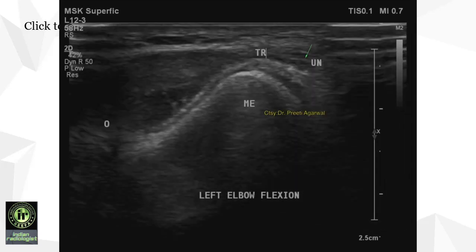On flexion, abnormal subluxation of the ulnar nerve is seen way beyond the medial epicondyle of the humerus. The normal position of the triceps tendon is seen lying at the level of the medial epicondyle. The structure marked as O is the olecranon process. The ultrasound shows ulnar nerve subluxation, which is the likely cause of the cubital tunnel syndrome seen on MRI.